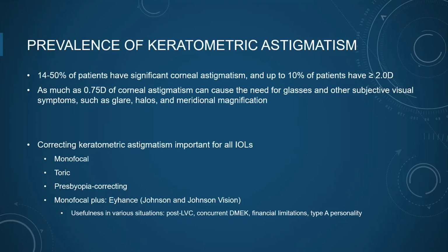And certainly now with the recent advent of the Eyhance, which is really not an extended depth of focus lens, I kind of call it a monofocal plus. It's sort of an in-between lens. But the Eyhance is a very useful lens for a lot of situations where patients want some presbyopia correction, but for either financial reasons or because of other things going on, they may not be the best candidate.